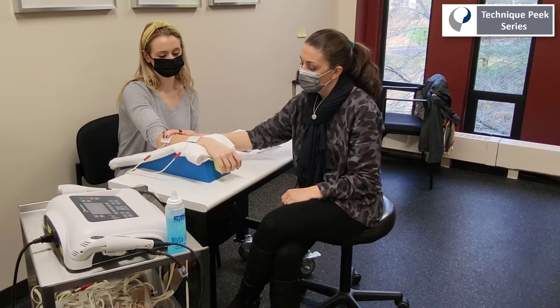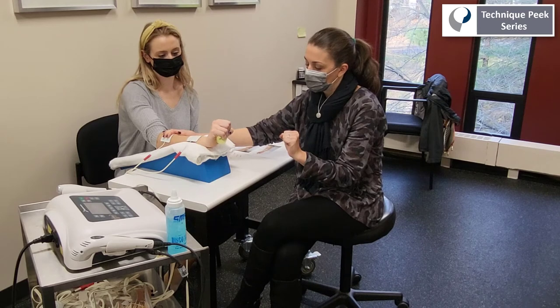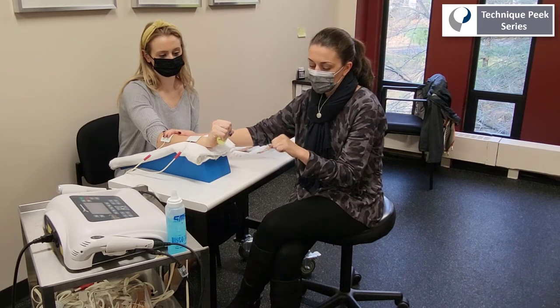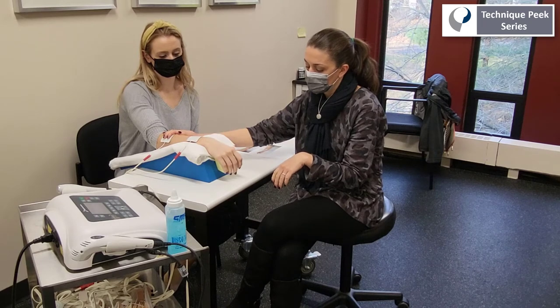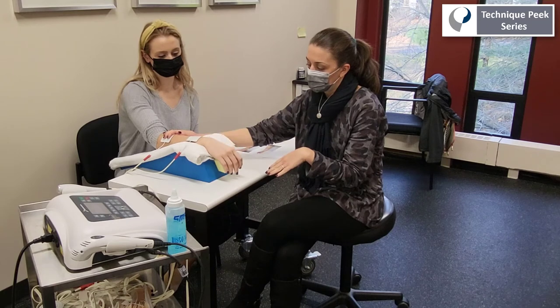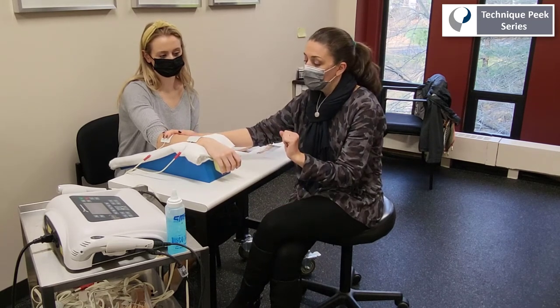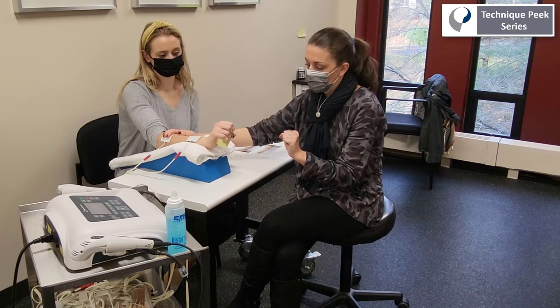Here, you're going to see when the stimulation is provided via the machine, the patient is going to actively extend their wrist and, in combination with active fisting, promoting that tenodesis response. And again, we're increasing the surface area of the cortical stimulation by having the patient recruit the muscles in addition to the machine providing the stimulation.